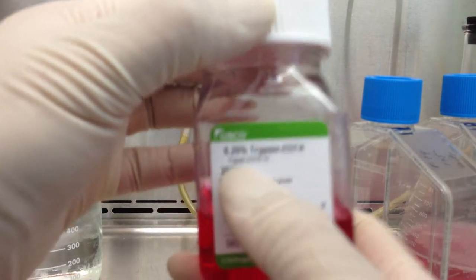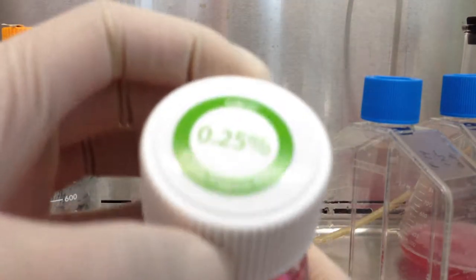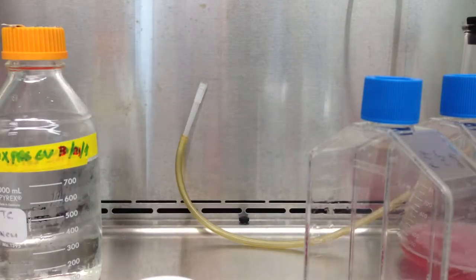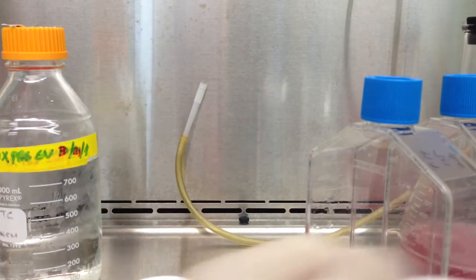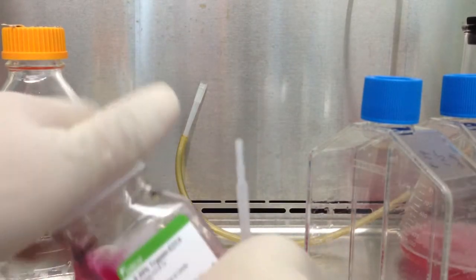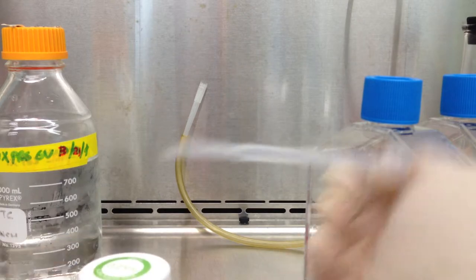So we actually use 0.25%. It's hard to tell, I guess. Disposable pipette. And we use 1 mil. Actually, I touched this, so it's been bad.